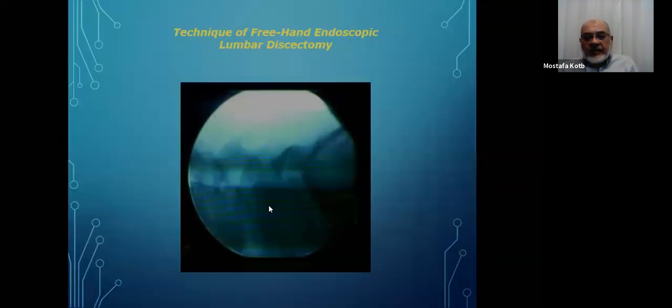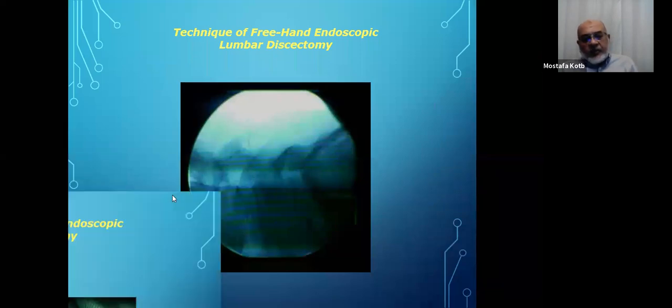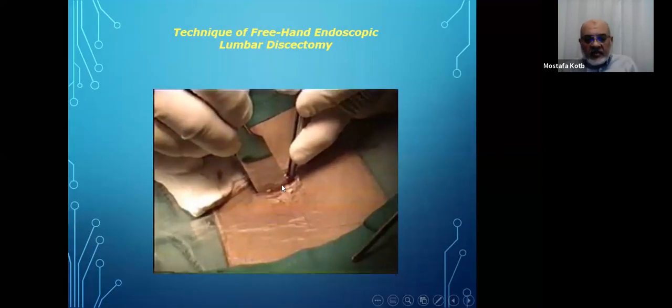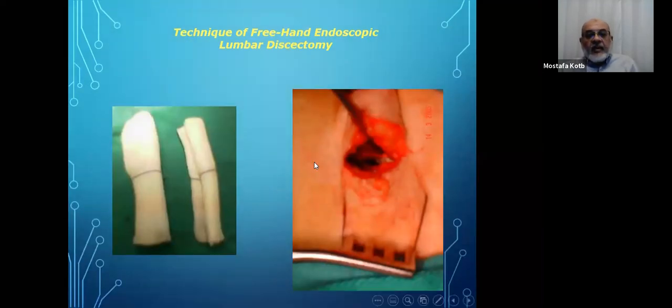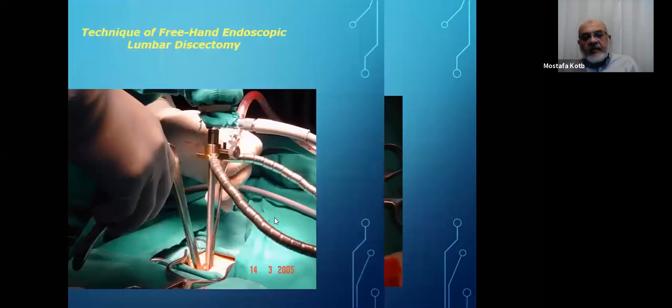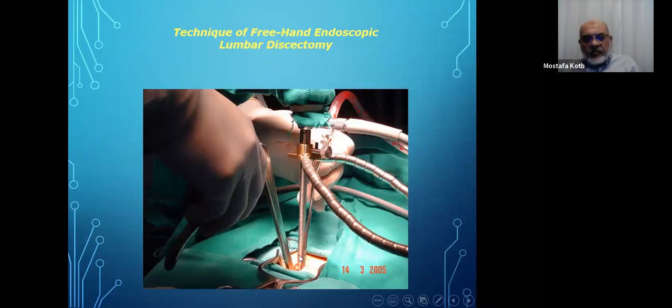Your patient is put in the prone position as usual, and you verify the level with fluoroscopy. And then you make a small midline incision of about 1.5 centimeters, between 1 and 1.5 centimeters. And then you do muscle separation at this level. After you separate the muscle, you insert two rolled pieces of gauze, caudally and cephalically, to create a small cavity between the two pieces of gauze, dorsal to the lamina. In this cavity, you introduce the tube for the endoscope, and beside it, to the right and left of the tube, you insert your instruments without having to do full dilatation of the muscles.